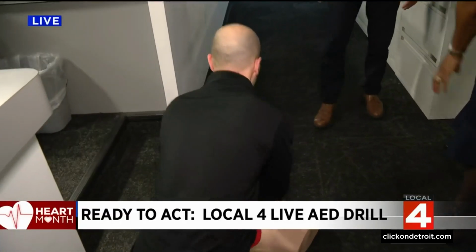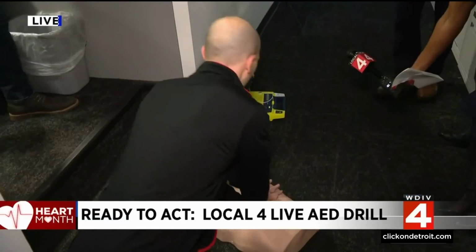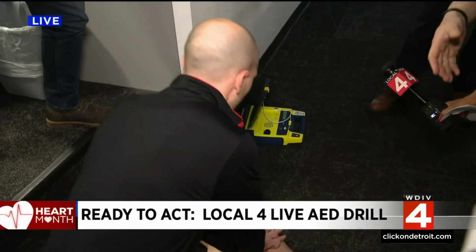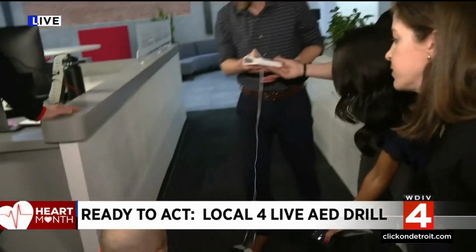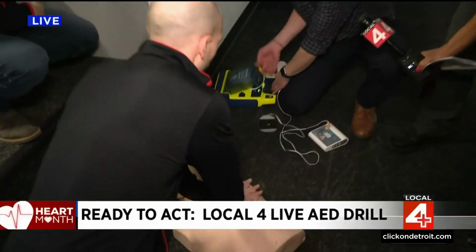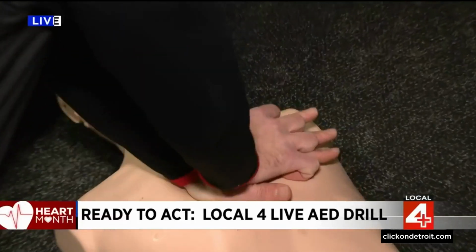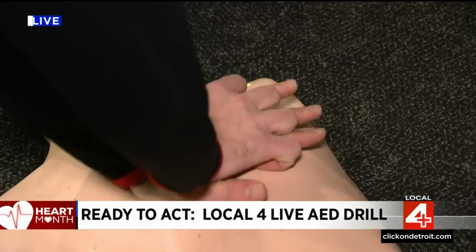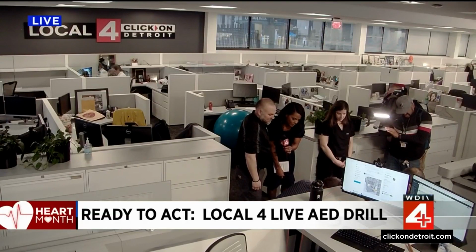The AED is here. Exposing patient's bare chest and torso. Remove or cut clothing if needed. When patient's chest and torso are exposed, remove square foil. And you can see with those two lights right there, he's actually doing the correct depth and correct rate right now. Okay. So he's doing good compressions. All right, so the AED speaks to you to make it really simple, so we're going to listen in.